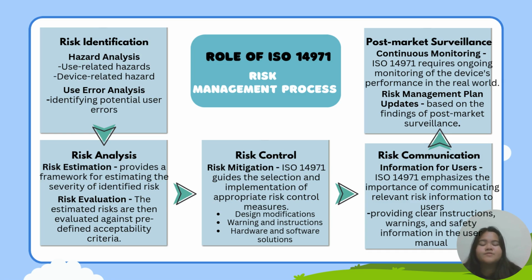The next one, we come to risk analysis. In risk analysis, first we will estimate the risk. ISO 14971 provides a framework for estimating the severity and likelihood of each identified risk. This helps prioritize risks and focus on the most critical ones.